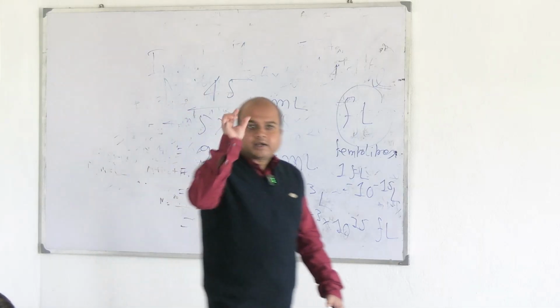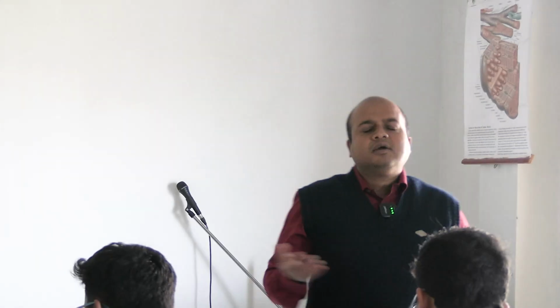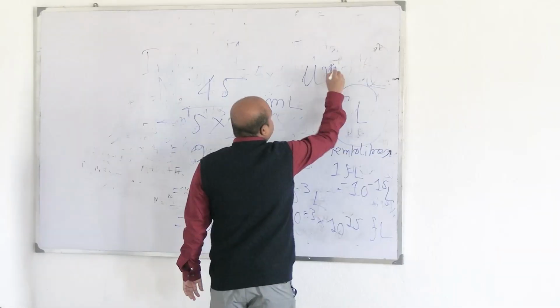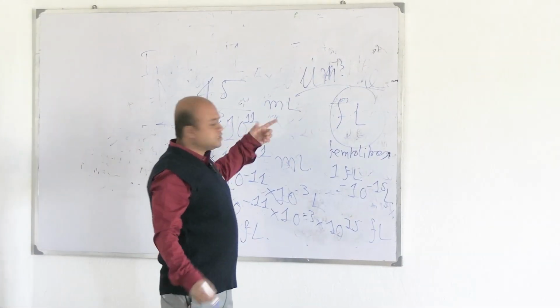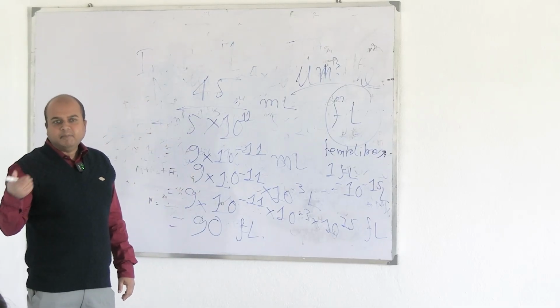Again, here we are taking 5 million RBCs. The theoretically accepted value of MCV is 78 to 92 femtoliters. 78 to 92 is the accepted range. If it is less than 78, we consider it a small RBC. If it is greater than 92, we consider it a large RBC. Femtoliters we can show in the CGS system, it will come to micrometer cube. So instead of starting with microliter, 1 microliter is 1 millimeter cube.